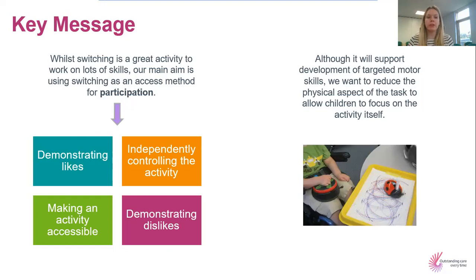So we want them to be able to show us, demonstrate if they like an activity, if they don't like it, to be able to be kind of independent in that activity as much as possible and just make that as accessible as possible for them. So switching is kind of our access method for activities. It is not the activity itself.